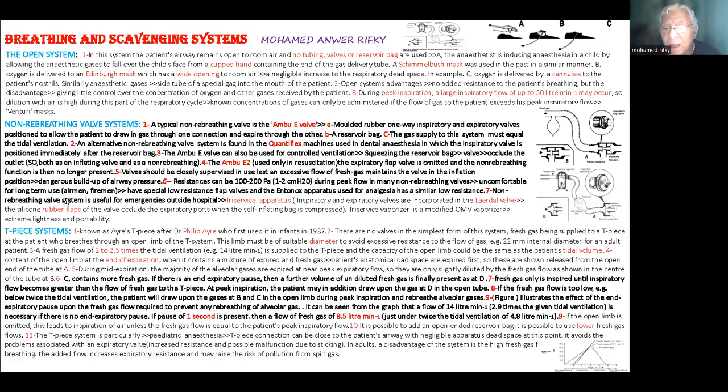Of course, airmen and firemen, airmen meaning the pilots, use such a system, so we have to have a special type of valve with minimal resistance.